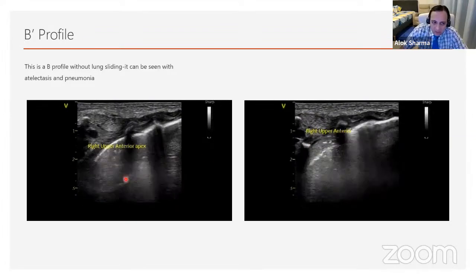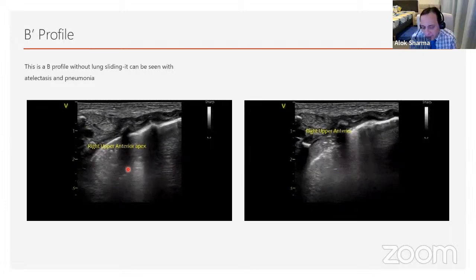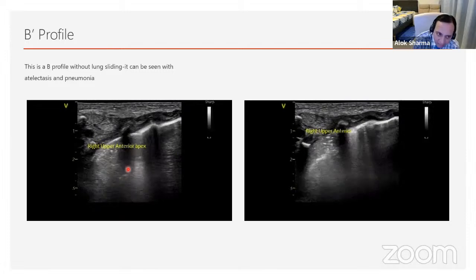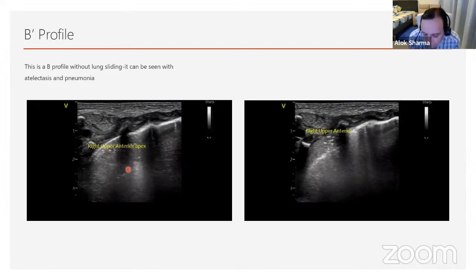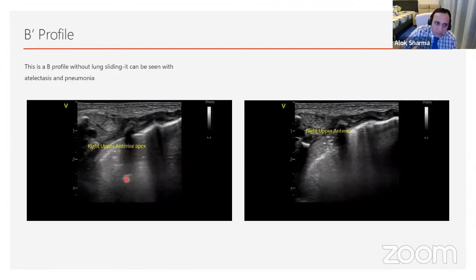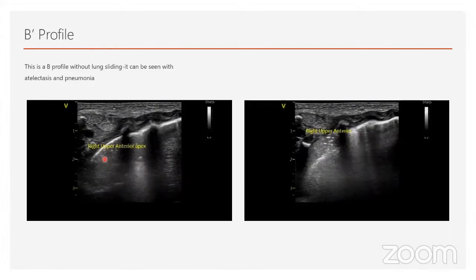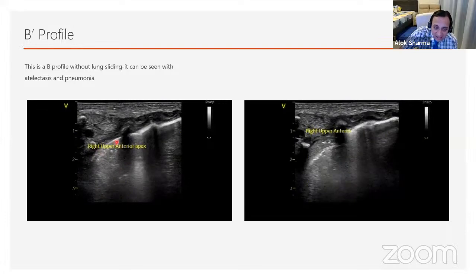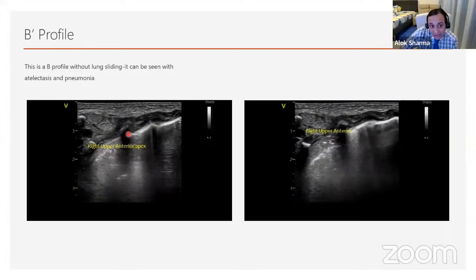When consolidation occurs for a variety of reasons, there is exudate and fluid in the alveoli and interstitial fluid in the interlobular space. But air can get into that exudate, in and out. So because air can get in and out, it will and can reach the pleural margin. Hence, I think a complete atelectasis is unlikely here.